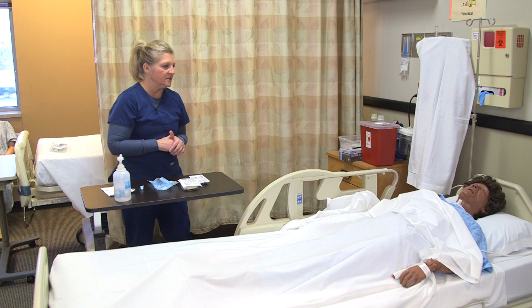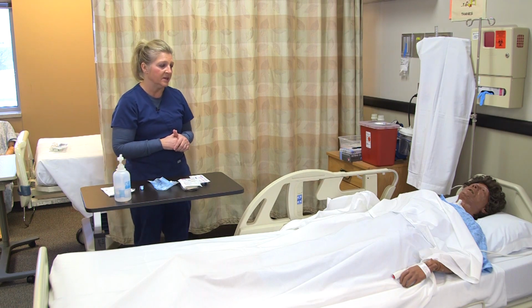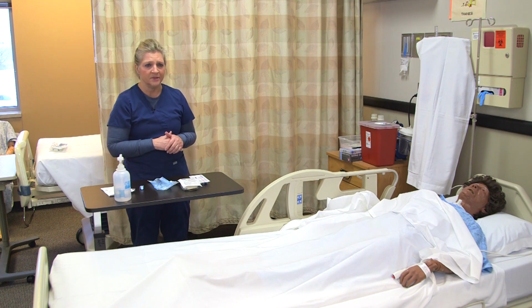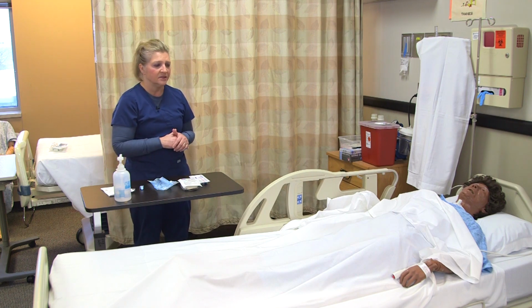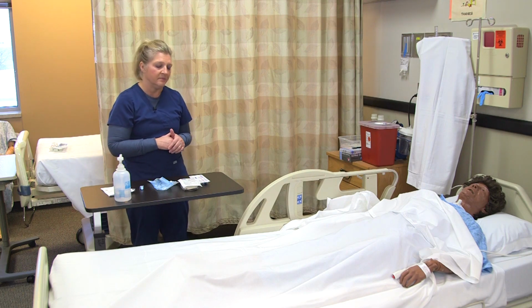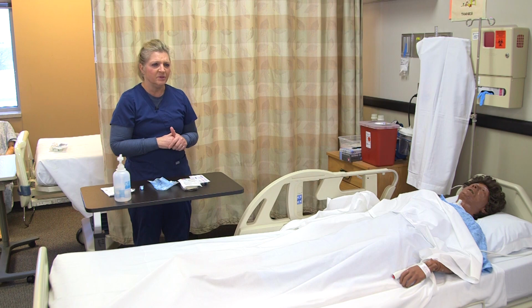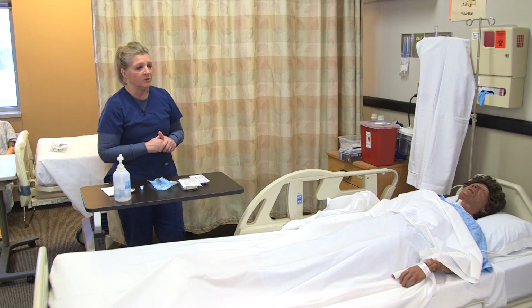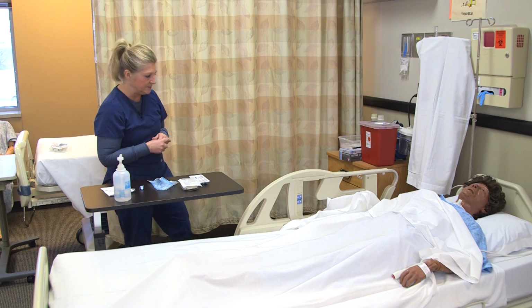So I look at the patient's past history, medical history, and I make sure that this is appropriate to perform on the patient. I also want to make sure that the extremity that I'm going to choose for the IV is free of any circulation problems, stroke, paralysis, lymphedema, perhaps from mastectomy. So I'm just going to note all that before I choose that extremity, and I will go for the other extremity if that's the case.